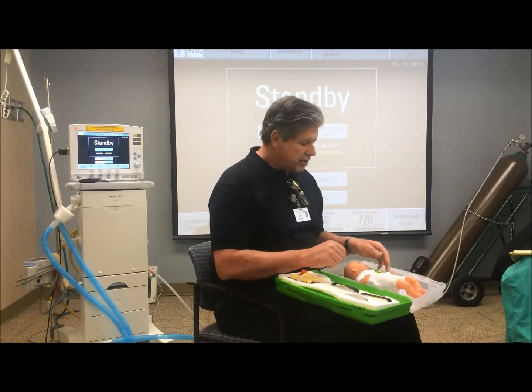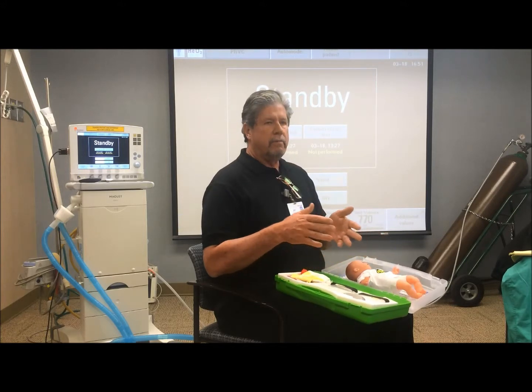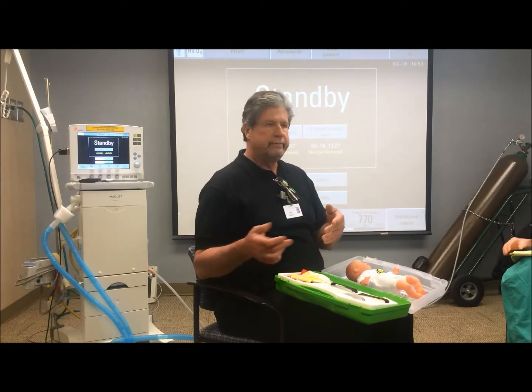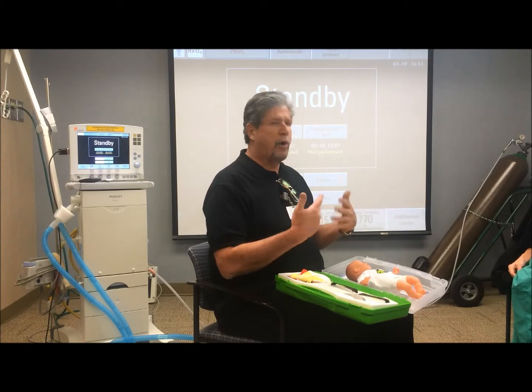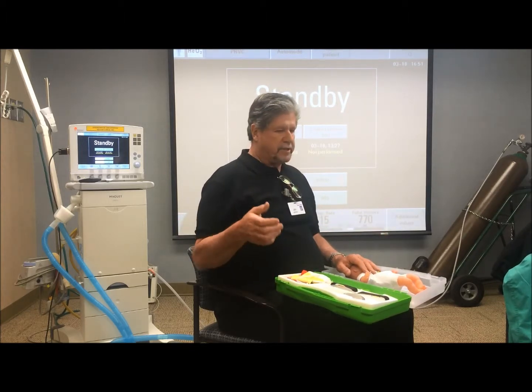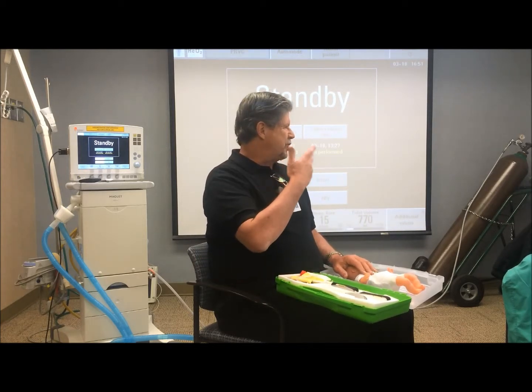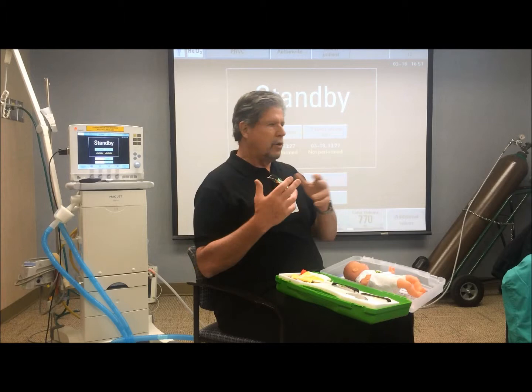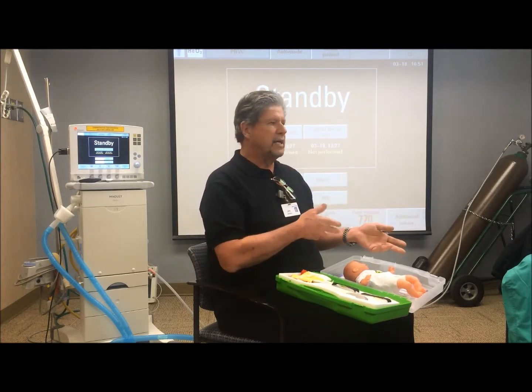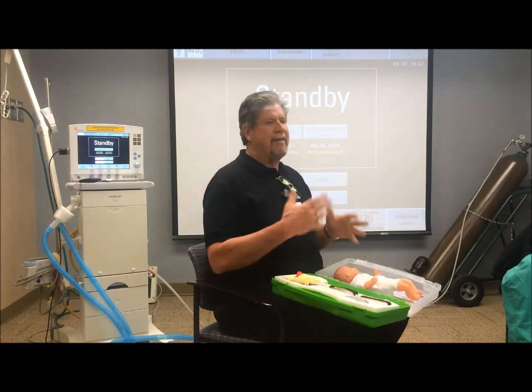Okay. So this is really just a substitute for Hudson prongs or Inca prongs or any other prongs that you talk about. And I always thought, even when I was a therapist, that you should have more than one device, because sometimes kids' faces are different, and this one doesn't work, but this interface does, but this one doesn't, and that one does, and so on and so forth. So it's nice to have an option.